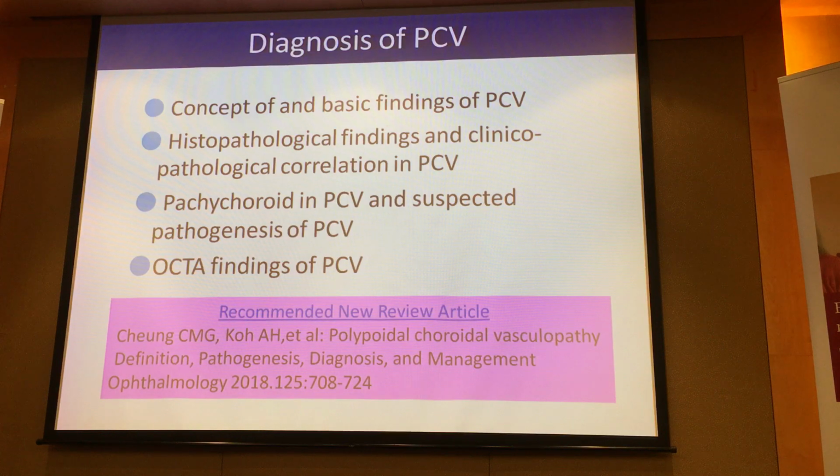Any discussion? For the study where you looked at PCV on the OCTA, where you demonstrated that the BVN and the polyp regressed and there was a recurrence, would you also see a reduction in the flow when the BVN and the polyps regressed? Because the intensity of the red seems to be consistent throughout.